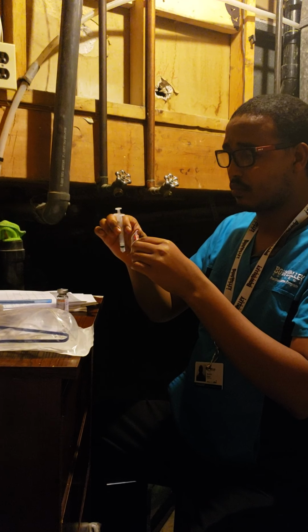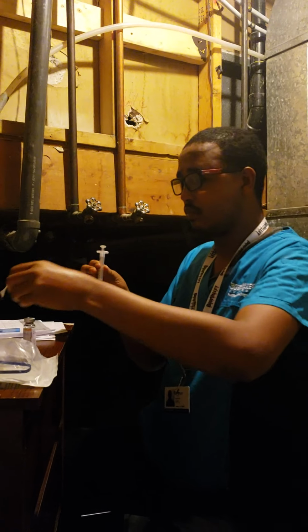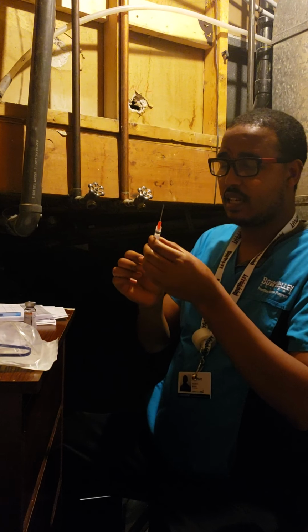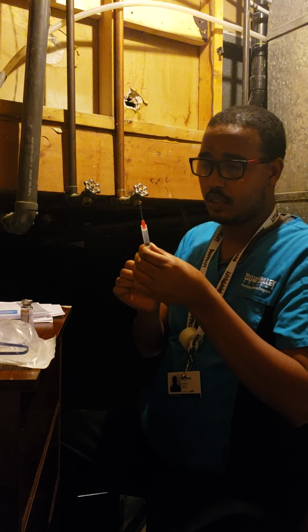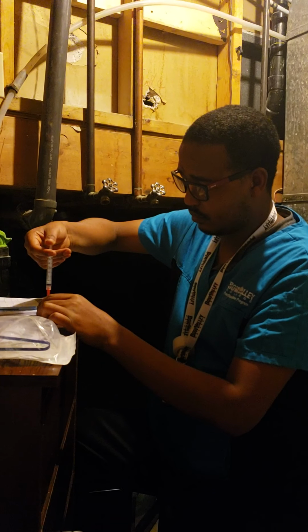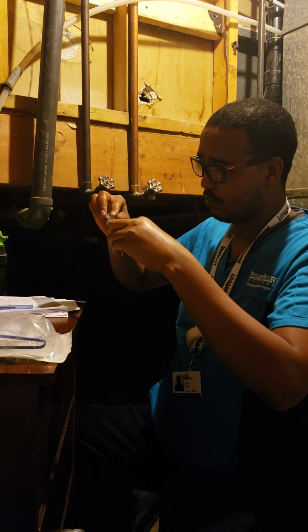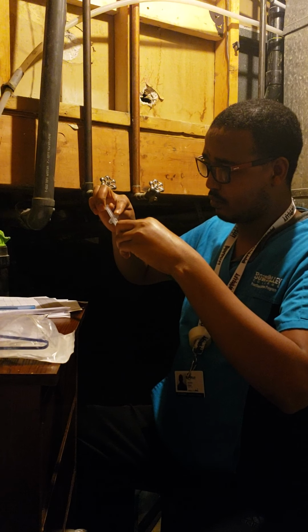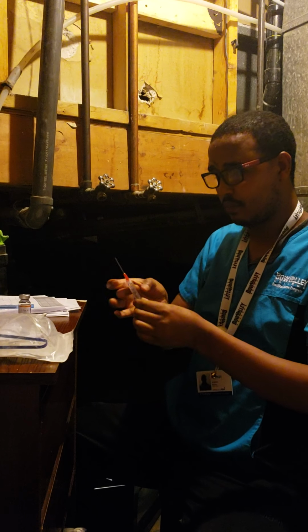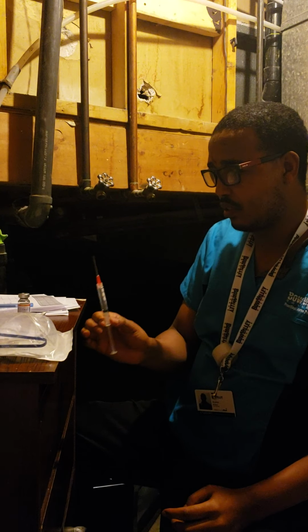So this is the vial. I'm going to inject 2 ml of air. Okay. Remove the bubbles.